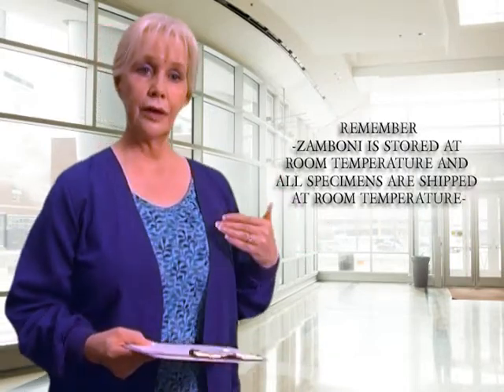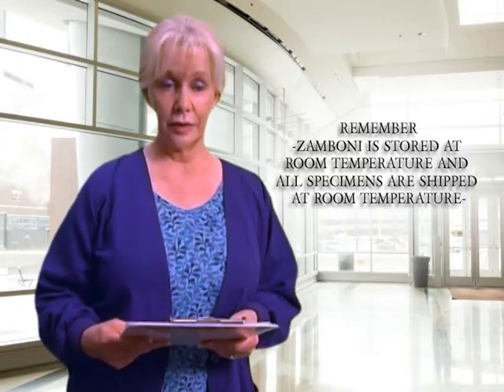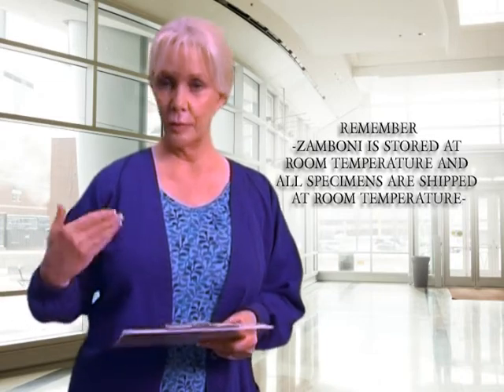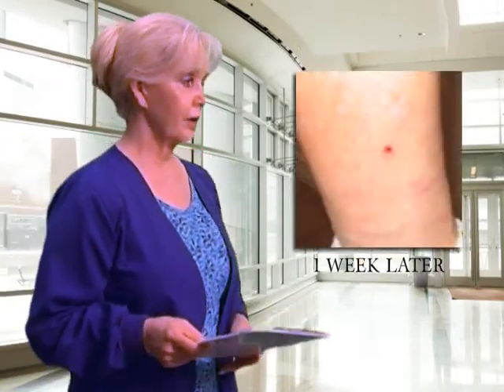The Zamboni is stored and shipped at room temperature — there is no need to refrigerate it and it does not expire. We will only provide you with a certain number of kits at a time, so please keep us informed when you need more supplies or more tubes.